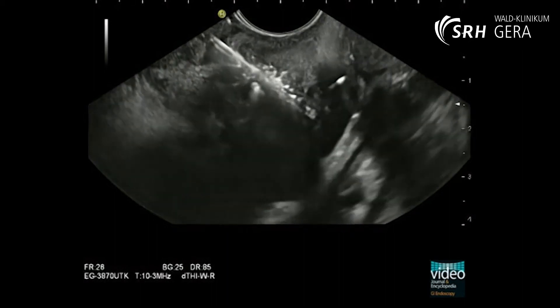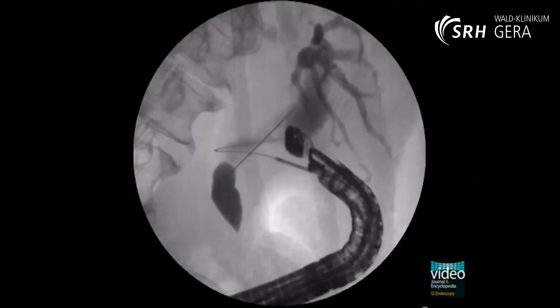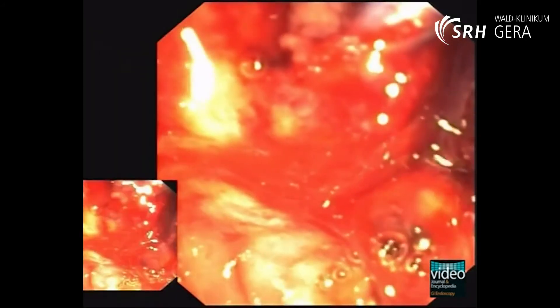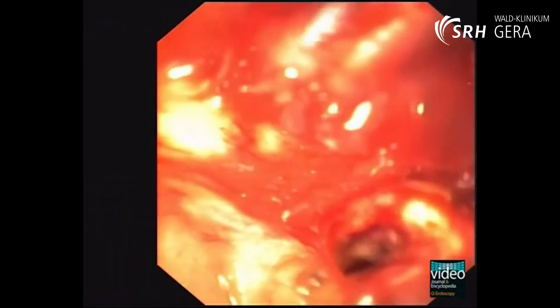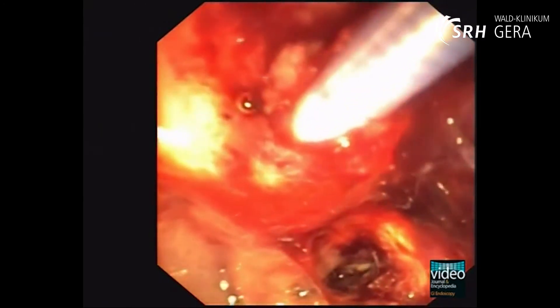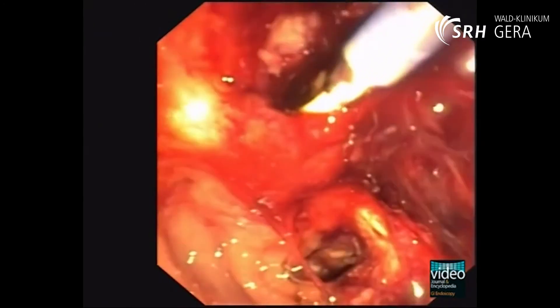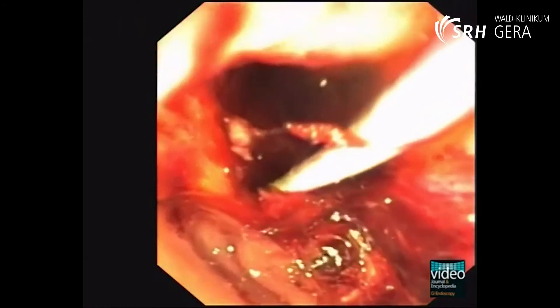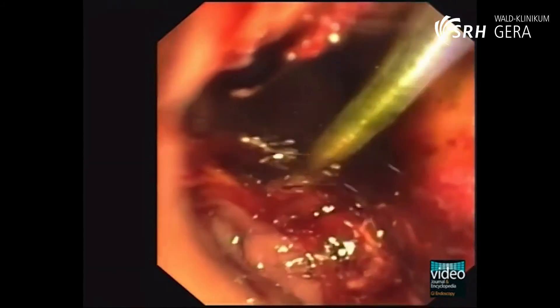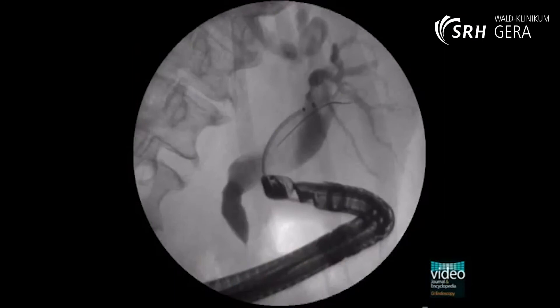Over the guide wire, a high-frequency ring knife is pushed forward up to the duodenal wall. Under alternating EUS and fluoroscopy control, the motion of the ring knife during high-frequency cauterization is followed carefully. This manoeuvre should be done two or three times depending on the distance and resistance of the intermediate tissue. When the ring knife, without cauterization, reaches the bile duct without problems, or spontaneous bile drainage out of the duodenal puncture site is seen, the next procedural step can be performed.